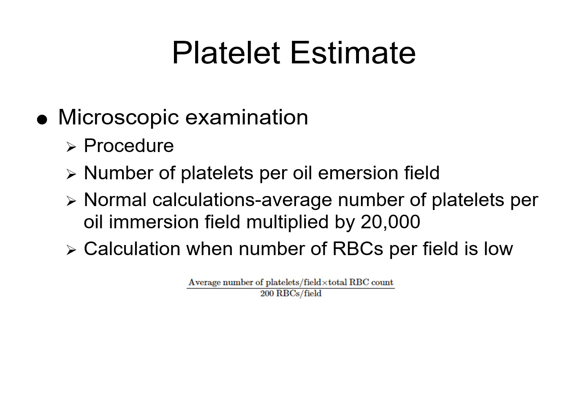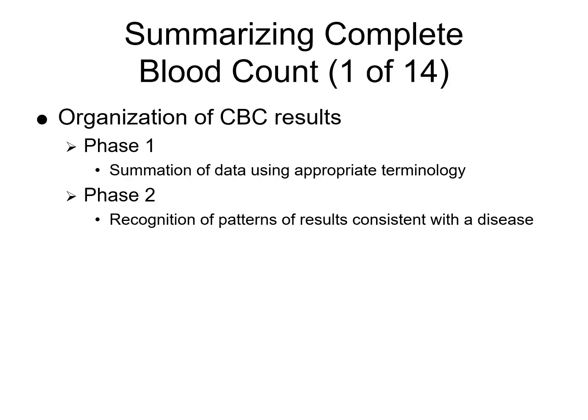For calculation when the number of red blood cells per field is low: if the red blood cell count per field is low due to a thin smear or other factors, the platelet estimate may be adjusted or confirmed with an automated platelet count for accuracy.